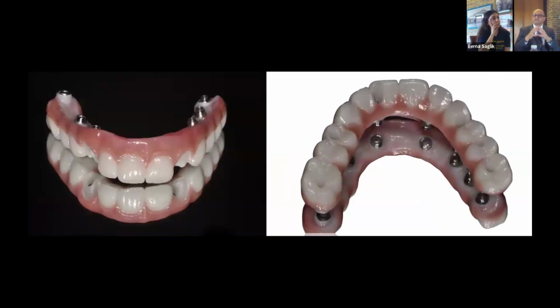And also sometimes, in clinical dentistry, we talk about, okay, you have to do bone reduction, the implant has to be placed here, all of that. When you do lots of cases, you realize that it doesn't matter what you do, some cases go out of your hand. Implant placement, bone is not there. Angulation is wrong. Whoever did the smile design is wrong. You want to correct it, you have to push the prosthesis back. Now the screw axis comes from the buccal. We all see that. When you practice a lot, you will see some failures.